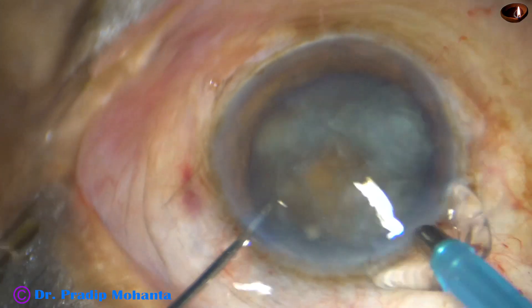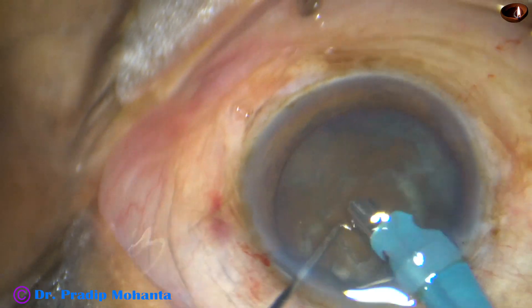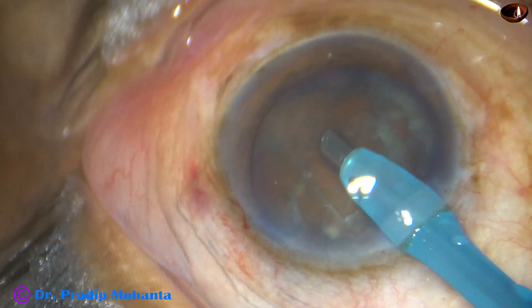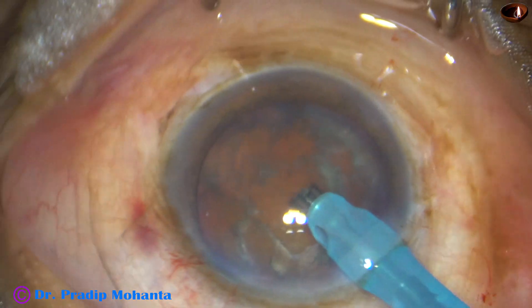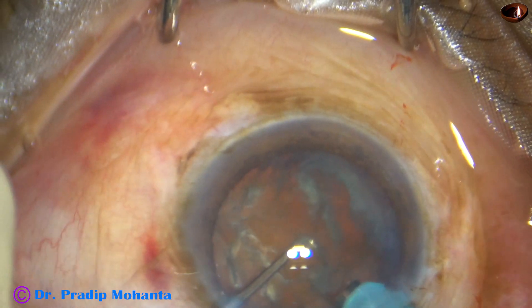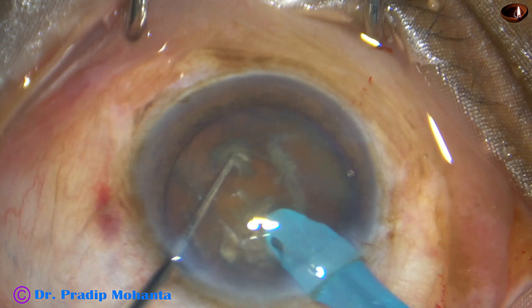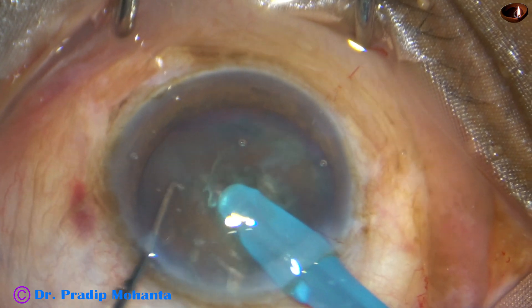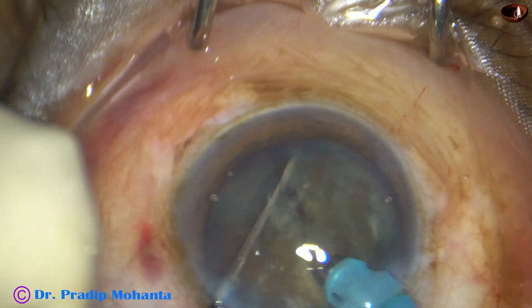The tip of the phaco needle is introduced into the anterior chamber and some superficial cortical lens matter is removed. I turn the handpiece, make the bevel up, and now I am going to try submarine chop. The tip is buried into the substance of the nucleus just in front of the main incision, and travels through the substance towards the opposite equator. As it reaches near the opposite equator, the chopper is used to divide the nucleus.